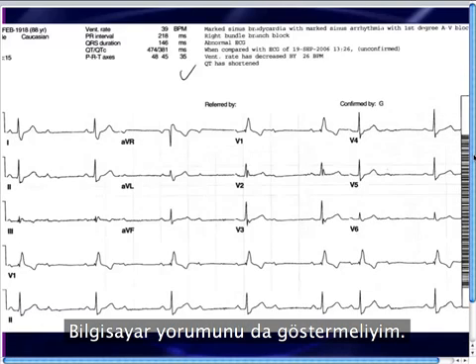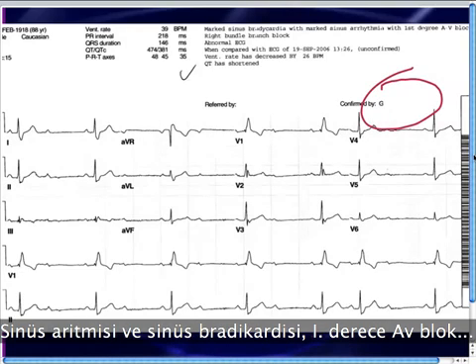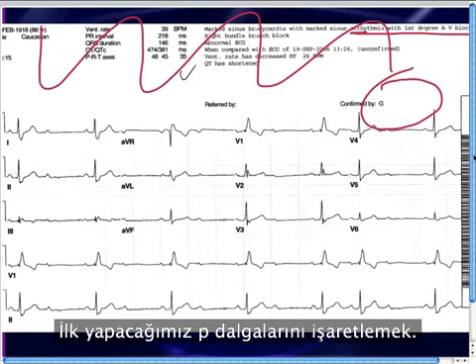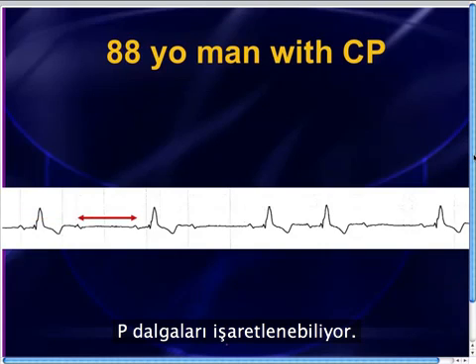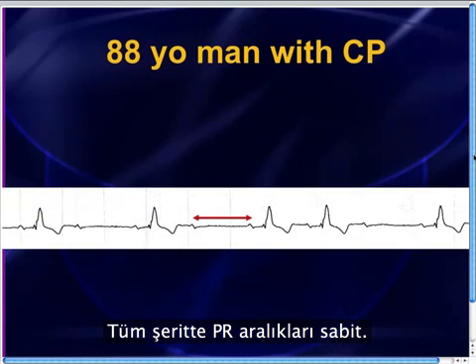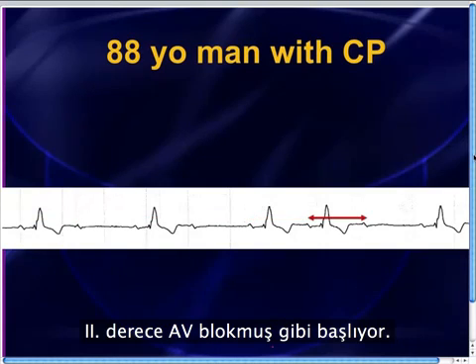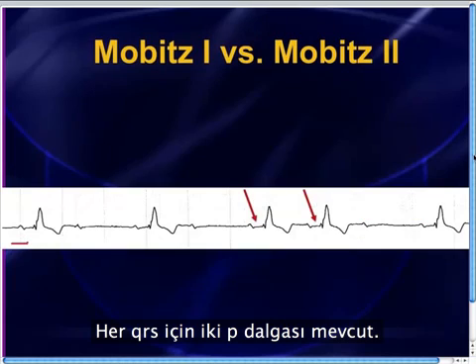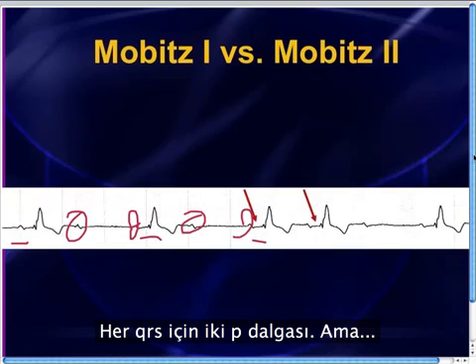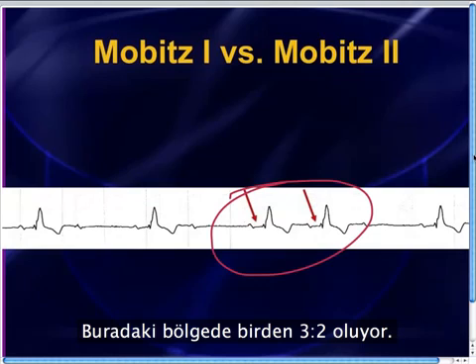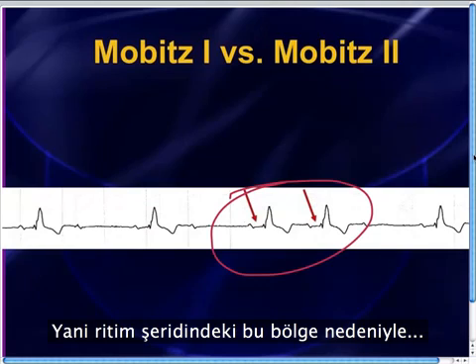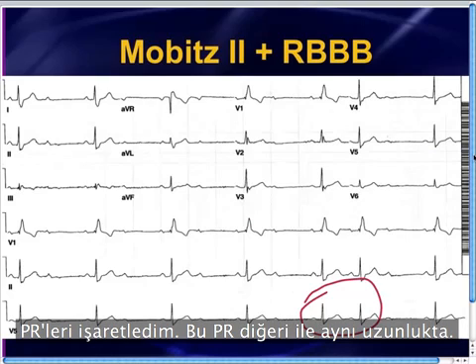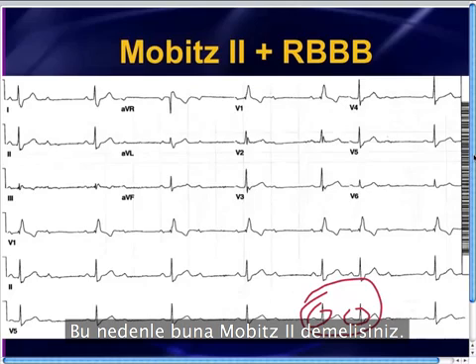Take a look at this one — I have to show you the formal interpretation by the cardiologist: 'sinus bradycardia with sinus arrhythmia, first-degree AV block.' Wrong, wrong, wrong — that's completely wrong. First, map out the P waves: the P-to-P interval stays constant all the way across. This starts out looking just like a second-degree AV block with 2-to-1 — two P waves for every QRS. But in one section it suddenly went 3-to-2. Because of that section, you get to make a diagnosis: the PR stays constant. When I mapped it out, this PR is the same length as that PR — therefore you get to call this a Mobitz 2.